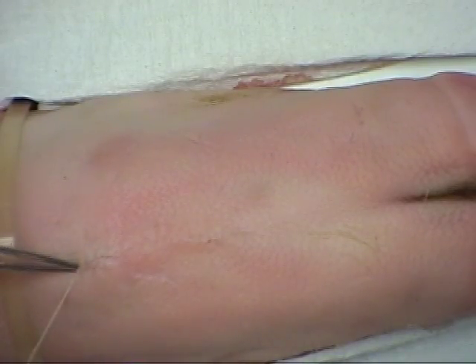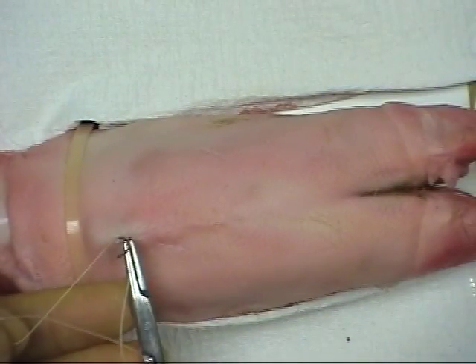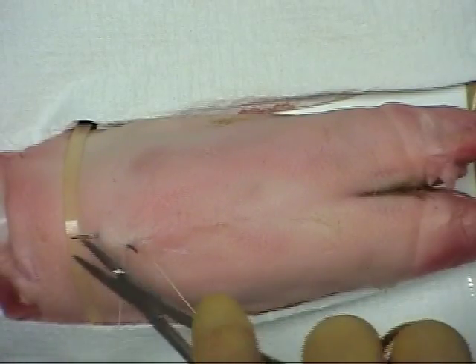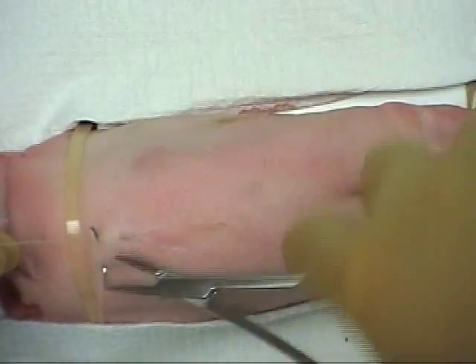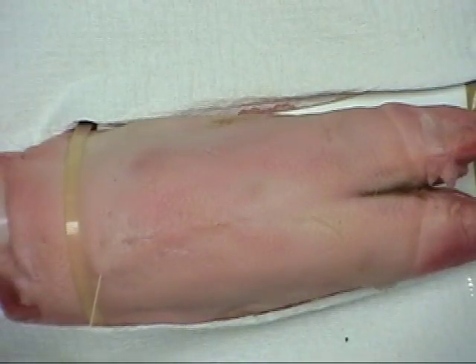Thus, to complete this closure, the needle is reinserted at the apex and driven through the tissues to emerge distal to the wound. A Z-shaped suture is placed, passing the needle back into the skin close to the previous exit point and driving it perpendicular to the incision.